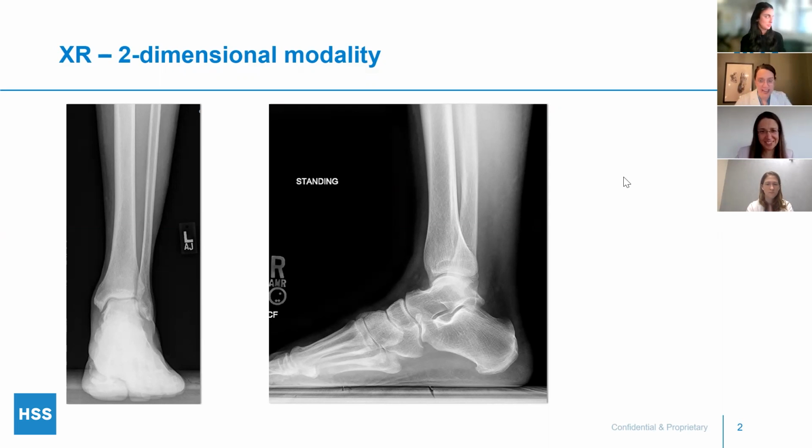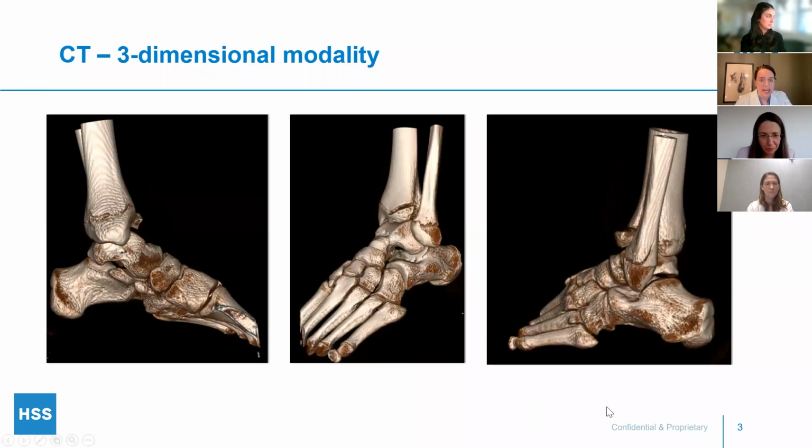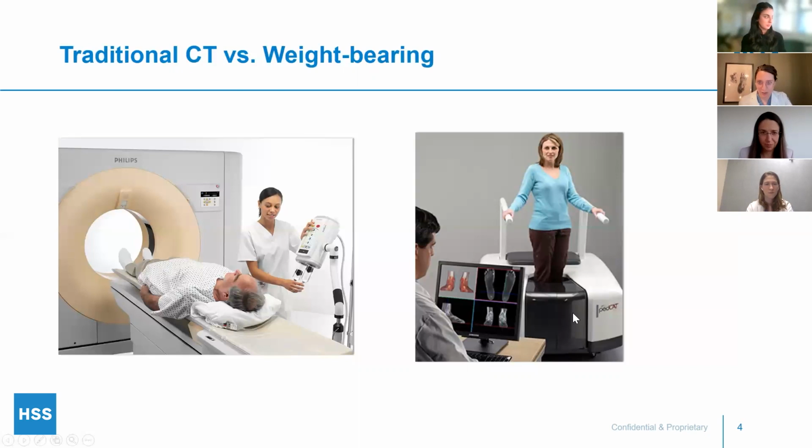So if you go to the next slide, one of the ways that we try to conquer that is with CAT scans or computed tomography. And traditionally, though, even though we got more 3D information about these, they were always done in the non-weight-bearing position. So if anybody has ever had a CAT scan out there, you know that you lie on a bed and you go into the tube. And if you go to the next image, I think it'll hopefully see exactly like the image on the left, you're in a non-functional position. Most people don't have orthopedic pain when they're lying down. It's often when you're trying to do activities or negotiate stairs or walk on the beach or something like that.